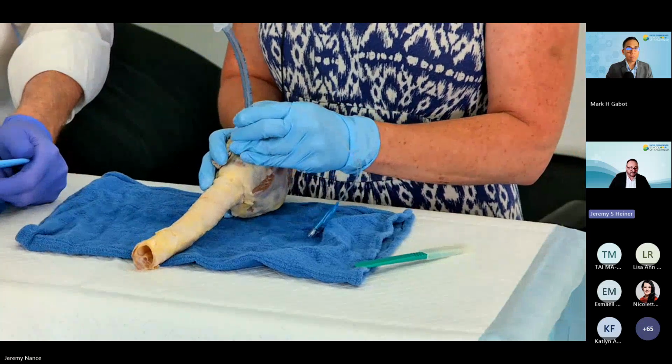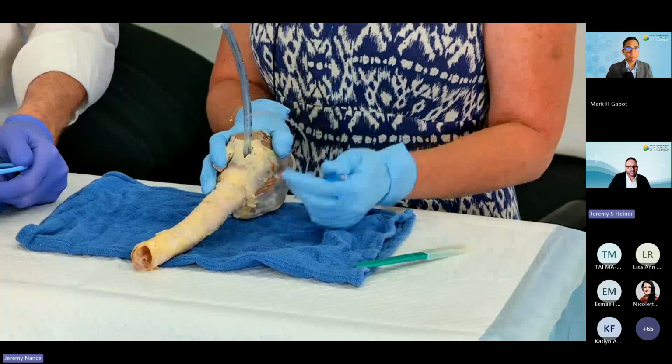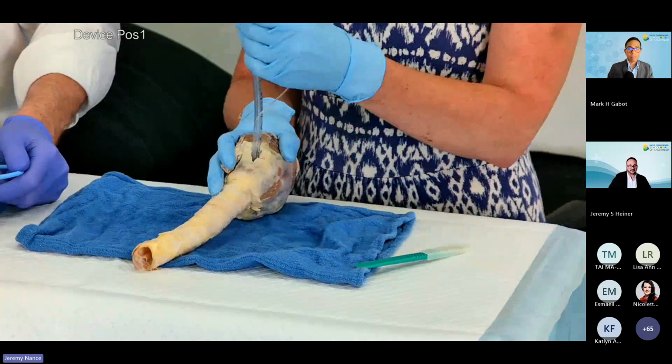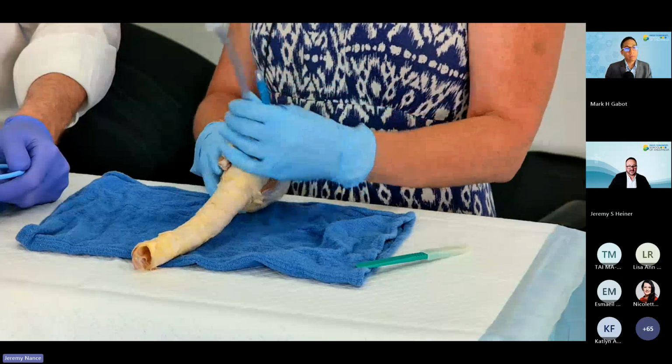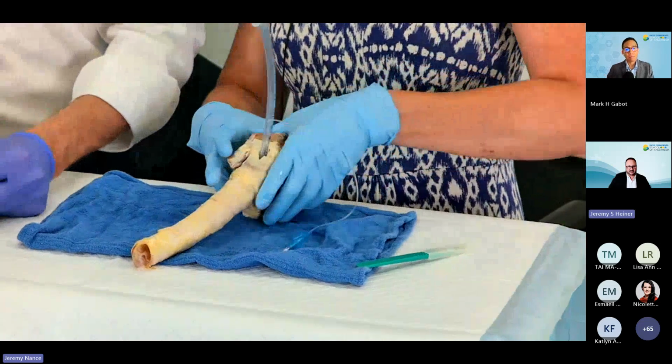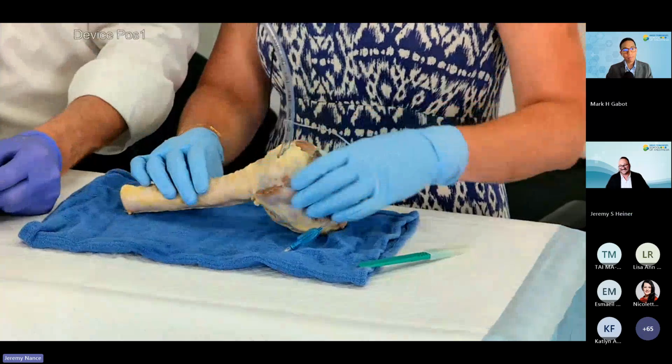We're going to inflate the cuff, and then I don't have a syringe, but we'll pretend, and connect it to our ventilation device. There you go. All right, Jeremy. Did it. So Jeremy, we definitely saved your pig trachea. I don't know if we saved it.